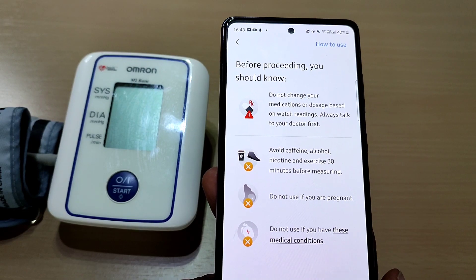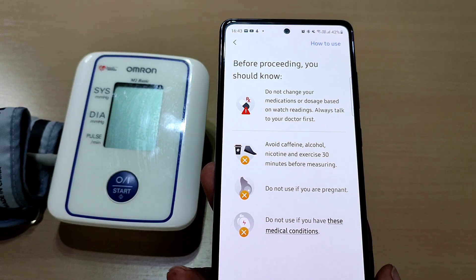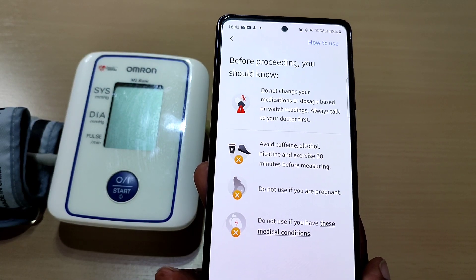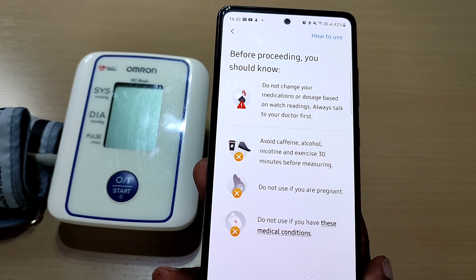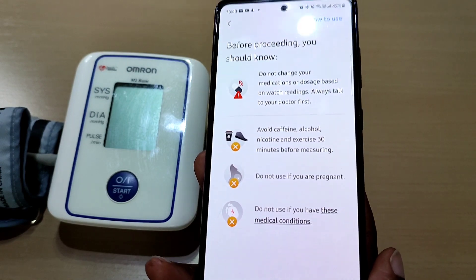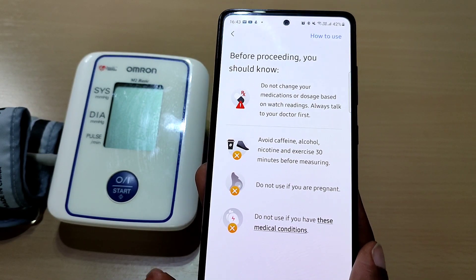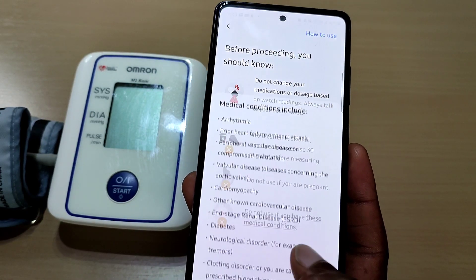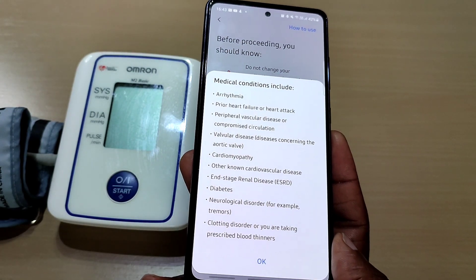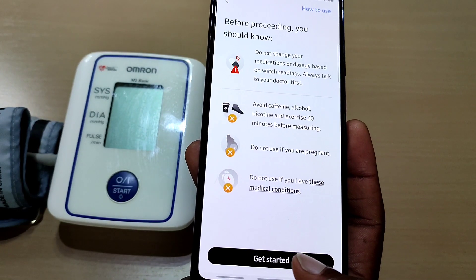Before proceeding, there are a couple of important notes: do not change your medication or dosage based on your watch readings — always talk to your doctor first. Avoid caffeine, alcohol, nicotine, and exercise 30 minutes before measuring as that could affect the reading. Do not use if you're pregnant or have certain medical conditions listed here.